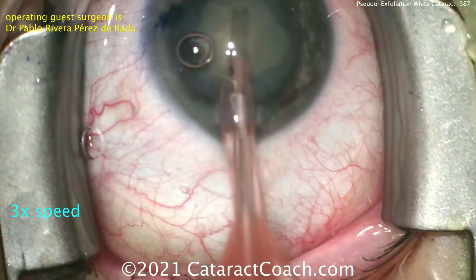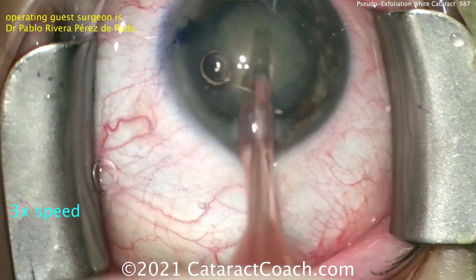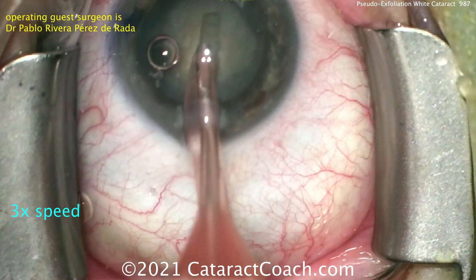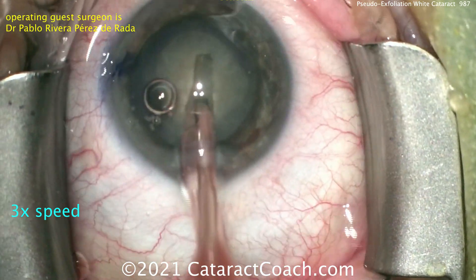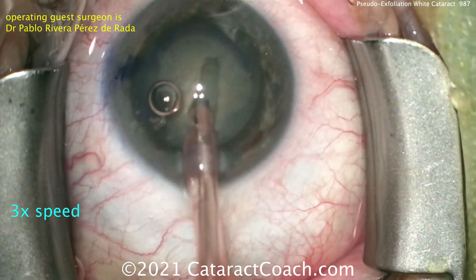There's the bevel up, and making a groove here. You can see that central groove is deeper in the center and thinner towards the periphery, because remember the human lens — the cataract lens is shaped like an M&M candy, thicker in the center and a little thinner in the periphery. So a little bit of extra effort to go deep in that central part of the nucleus.